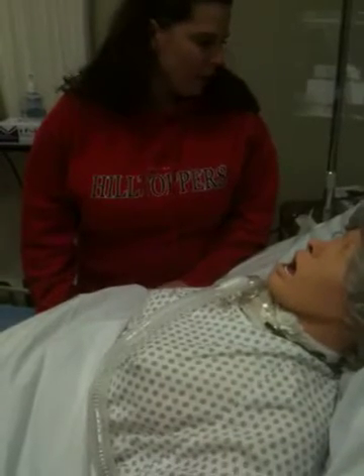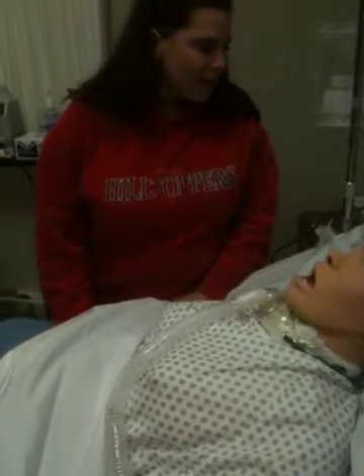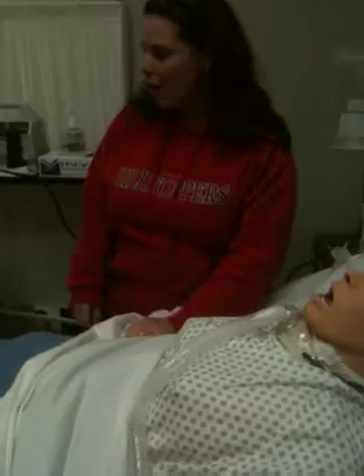I'm going to walk into the room and say: 'Hi Mrs. Olsen, my name is Melanie Duke and I'm going to be the nurse taking care of you today. The doctor has ordered for you to have an NG tube hooked to suction.' So I'm going to get all my supplies ready. The first thing I would like to do is listen to your bowel sounds — I'm going to auscultate her bowel sounds.